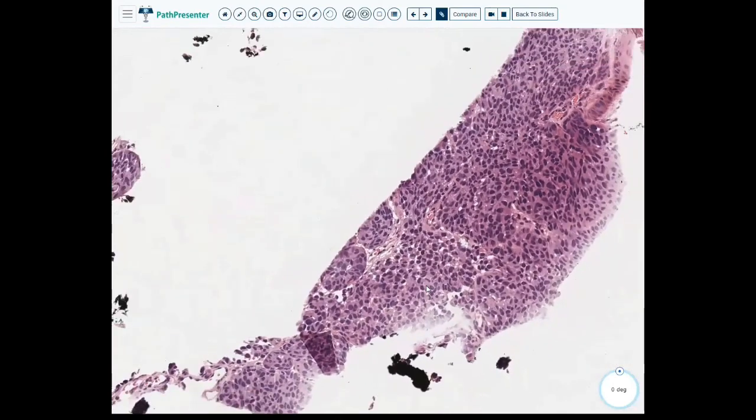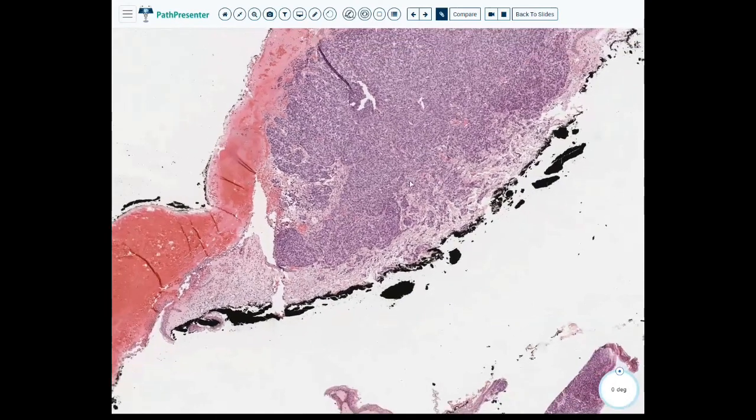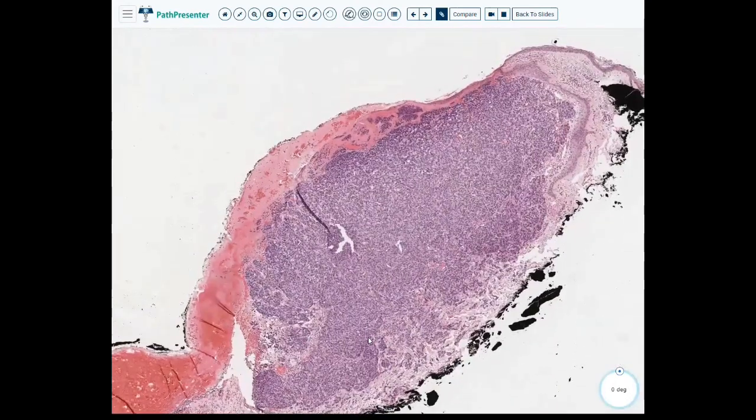And you would have to mention that it's ulcerated, okay? We would mention the size, that it's ulcerated. There is quite a bit of mitotic activity, so maybe it wouldn't hurt to do a Ki-67, since that's also one of the prognostic factors that they can look at to determine what's going on. But I think the fact that this already has serum crusting and is ulcerated, I feel like this is already saying that this is going to be a poor actor.